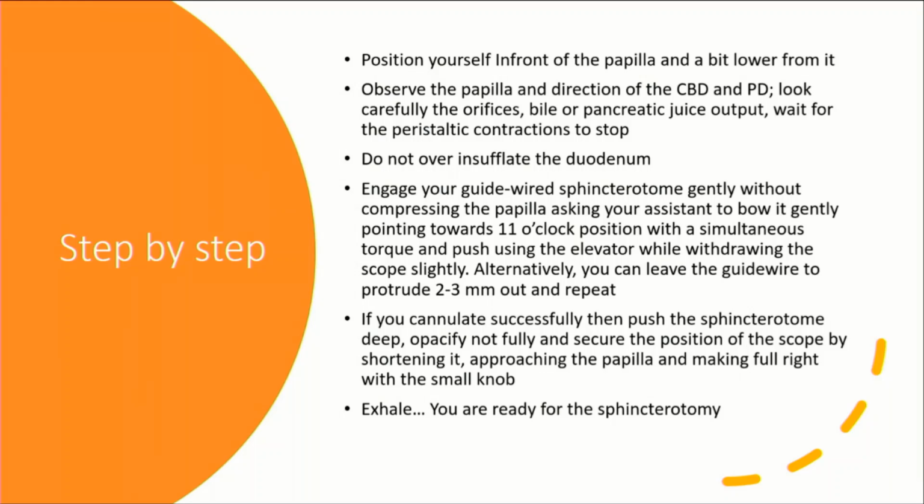Now, let's try to simplify it, to break it down as much as possible. So, important, the position. Position yourself in front of the papilla and a bit lower than it, as I explained before. At the beginning, it takes some time. You need to spend a few seconds, minutes, just to observe the papilla.